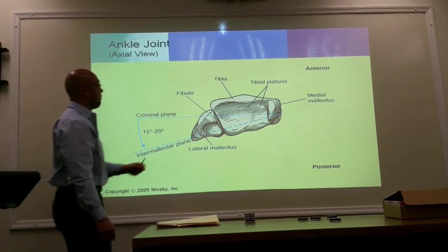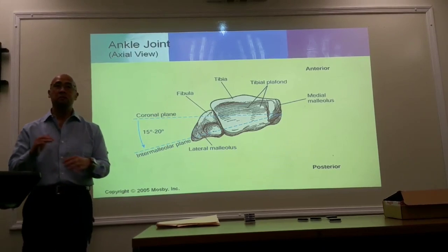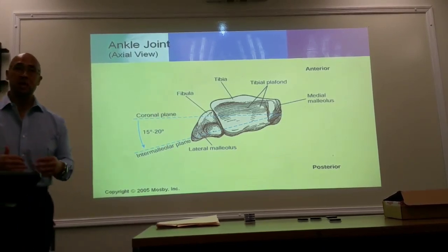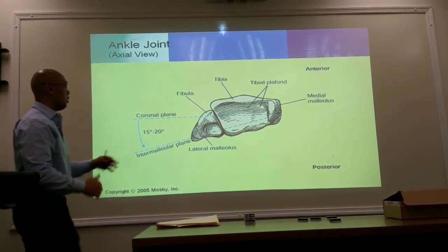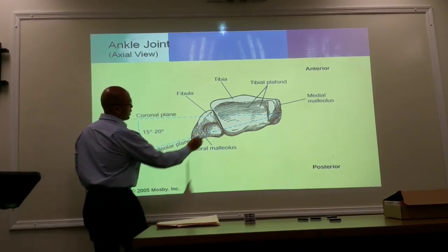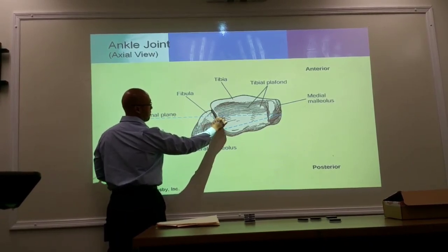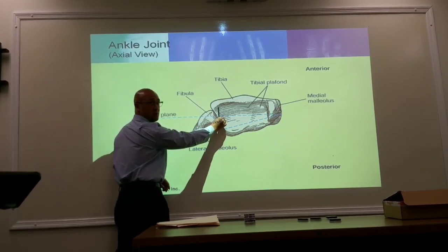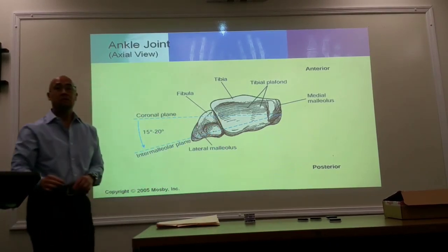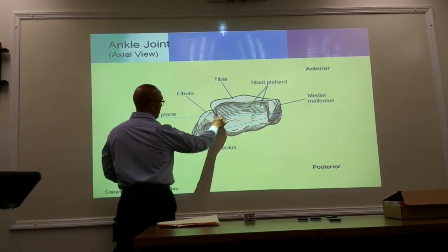So if I wanted to evaluate this joint space, there is going to be a difference of 15 degrees to open that space up. To straighten out this joint, if I wanted to look down at this joint, I would have to rotate my ankle medially about 15 to 20 degrees.